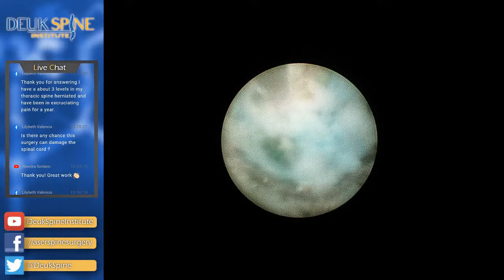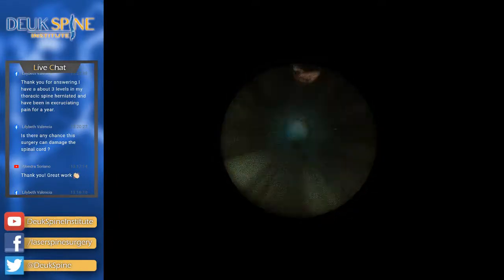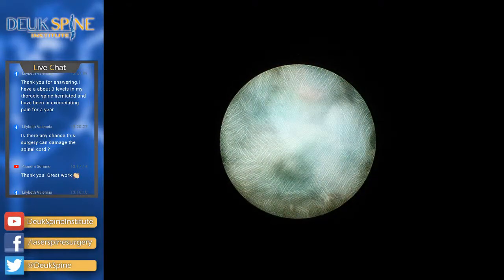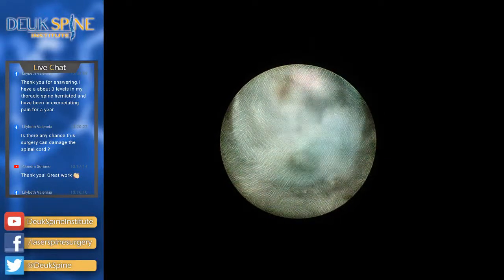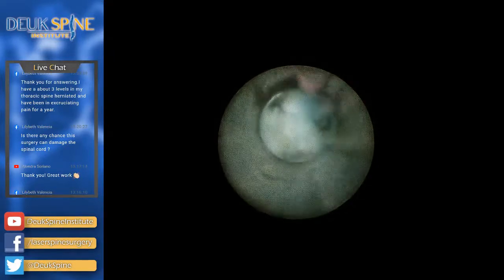But the problem is if you use a rod lens system, any kind of bending of the shaft would result in the lenses popping out of place. That's a big herniation right there. As I'm trying to get in there and see things and do things, I'll be bending the shaft. So fiber optic doesn't have lenses to pop out of place. It has fibers. I think there are 5,000 fibers, as a matter of fact. Either 5,000 or 500, I can't remember the number. The picture is not as clear because it's not a rod lens system. You're using a bunch of little tubes that transmit visual information rather than using the rod lens system. But gosh, that's a pretty darn good picture for endoscopic surgery.